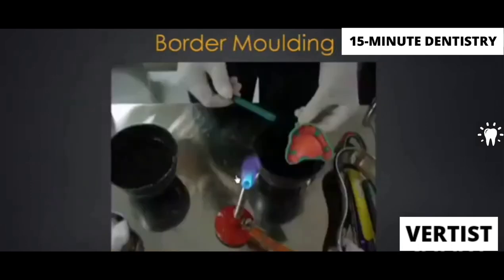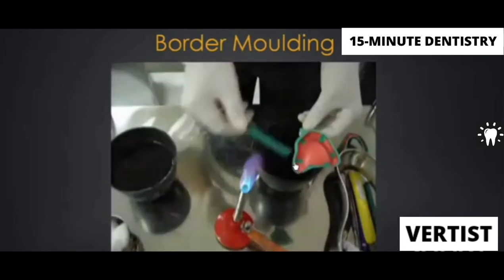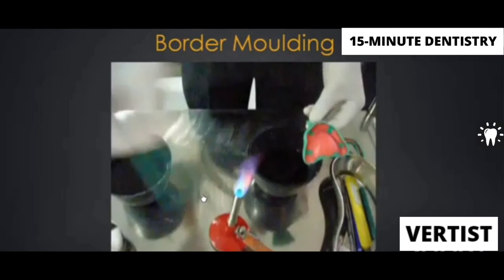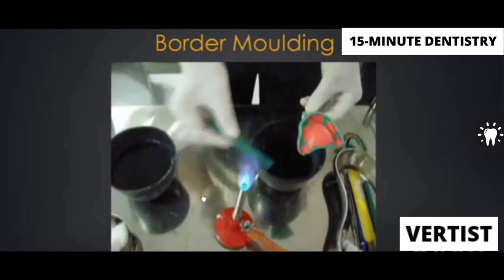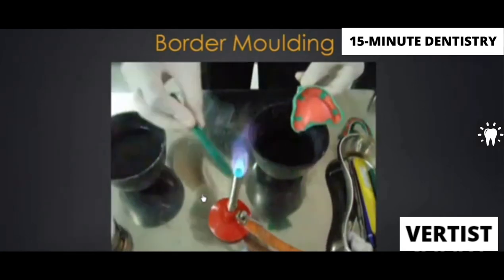Once you are happy with all the extensions, we want to do border molding. I'll just show you very quickly how we want you to heat the green stick material. Okay, the green stick material is not supposed to be held on the flame for a long time. Don't just hold it on top of the flame till it starts burning. Don't do that. You are supposed to continuously keep on moving the green stick material through the flame.